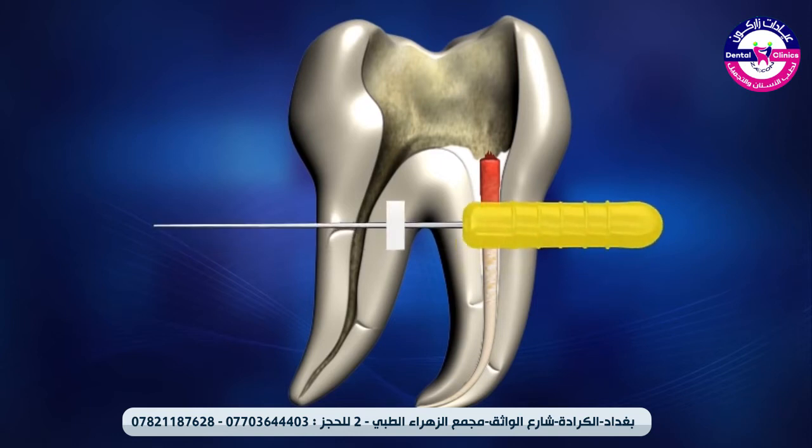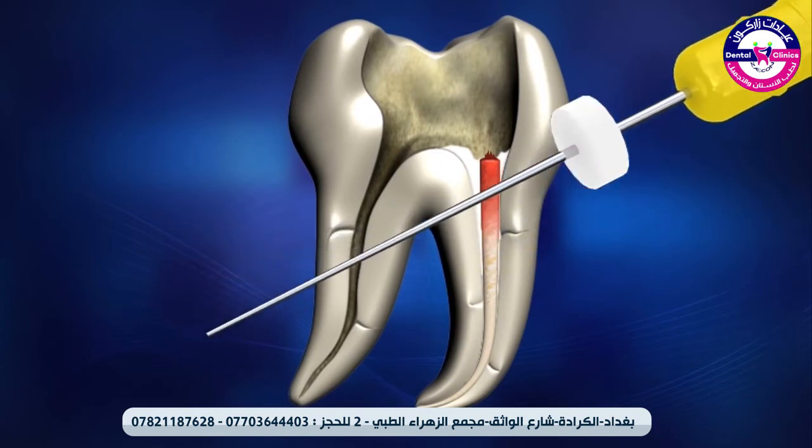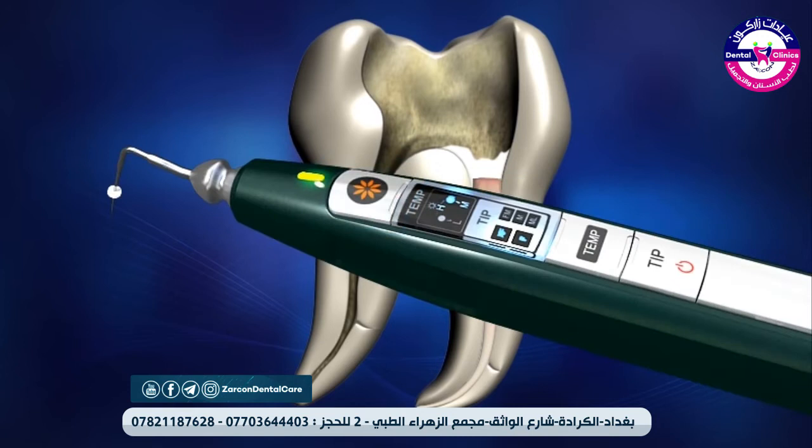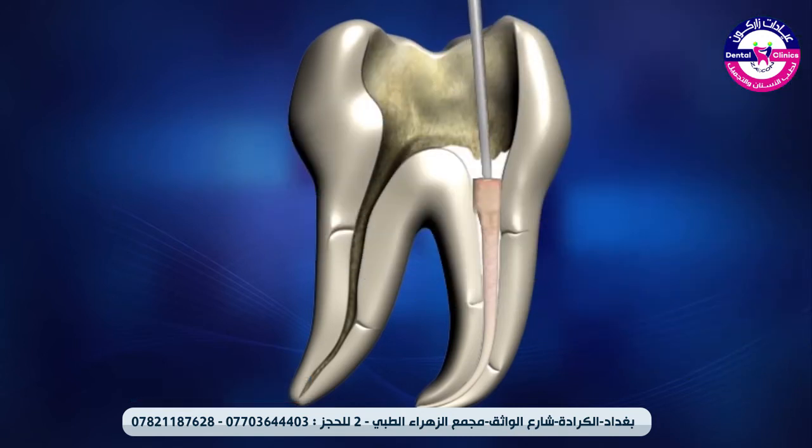After cutting the master cone, use the selected hand plugger to condense the softened material. Place the endo stop on the pen tip 1 millimeter shorter than the pre-measured working length. Insert and advance the heated pen tip to condense the gutta percha to within 3 to 4 millimeters of the binding point. Softened gutta percha cone material will fill the root canal.